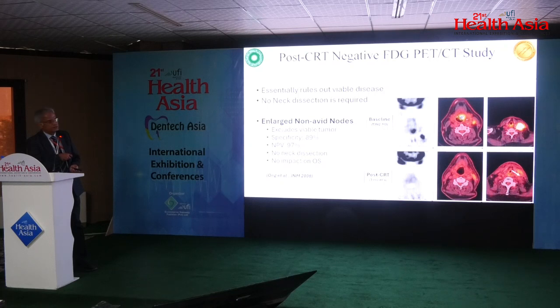In this regard, one study was published in 2008 where they found that there is a metabolically non-avid hypodense lymph node, and in such patients they considered that it excludes the viable tumor with a specificity of 89%, negative predictive value of 97%, and these patients did not undergo neck dissection without compromising the overall survival.